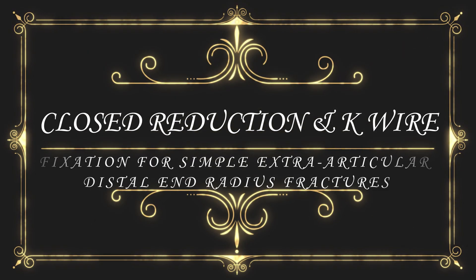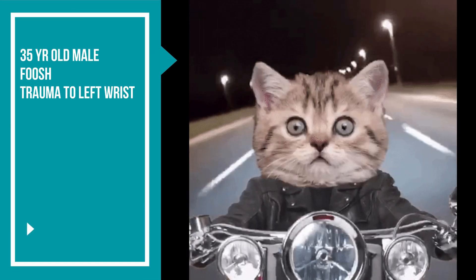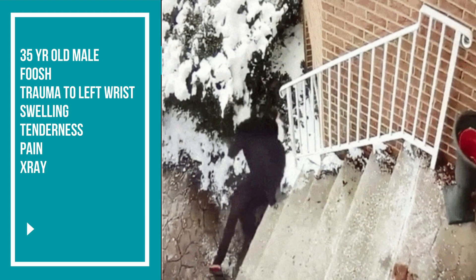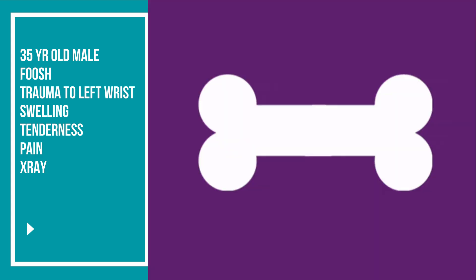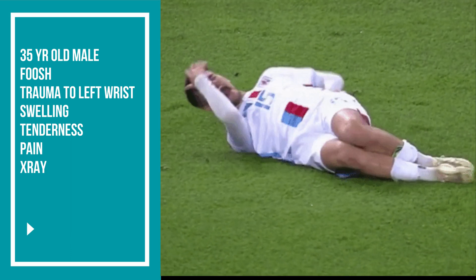Welcome. Today we are going to learn how to perform closed reduction and K-wire fixation for a simple extra-articular distal radius fracture. A 35-year-old male patient presented to the emergency room with a history of fall on an outstretched hand with trauma to his left wrist. The patient had swelling, tenderness, and crepitus over the wrist and was in a lot of pain.